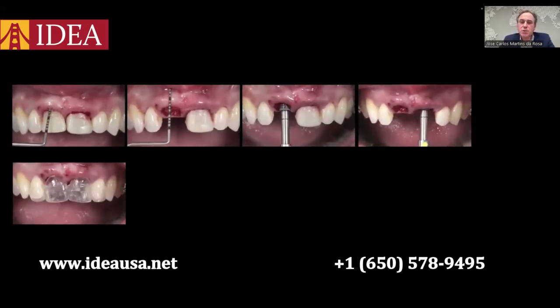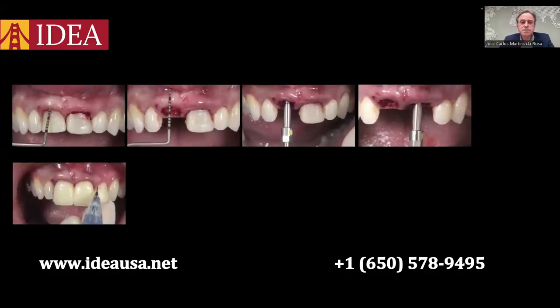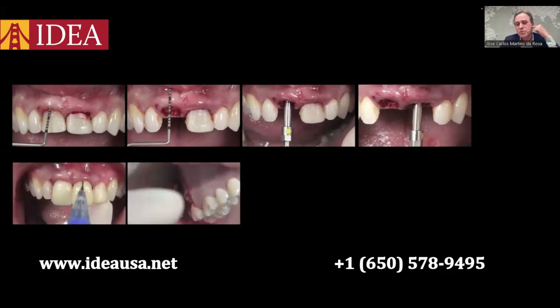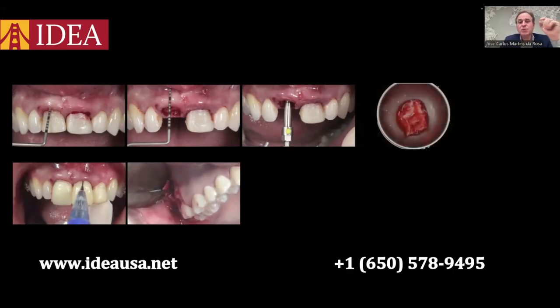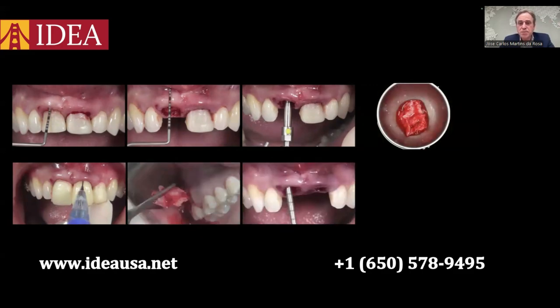Immediately after the implants were in place, we made my provisional bridge with ideal emergence profile. We harvested bone graft from the right tuberosity using chisels. We manipulated this graft according to the defect configuration and replaced these two walls with 2 block bones to restore the facial walls in these 2 implants.